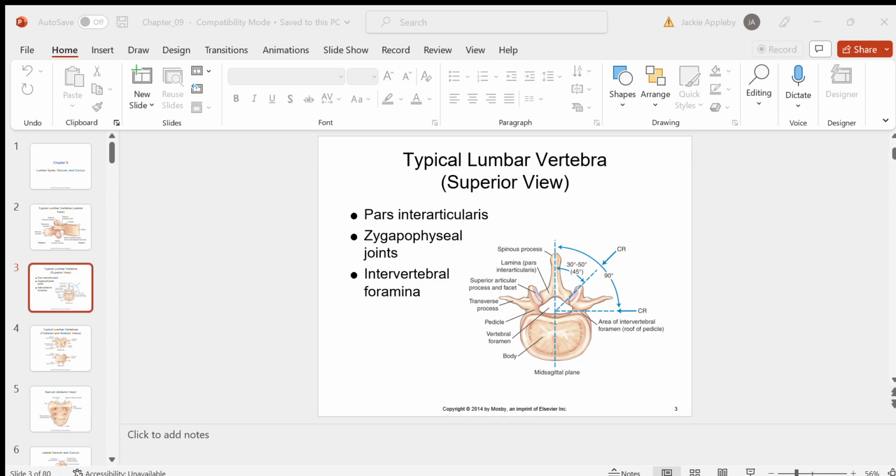And in the lumbar spine, an oblique of about 45 degrees shows you those joints. We do more obliques of the lumbar spine than we do of the thoracic spine. If you remember last week, the essential projections for thoracic spine did not include the obliques. They're in the book, but I didn't give them to you as an essential projection. But the lumbar spine, you'll have them. We need to be able to see the lumbar spine zygapophyseal joints.